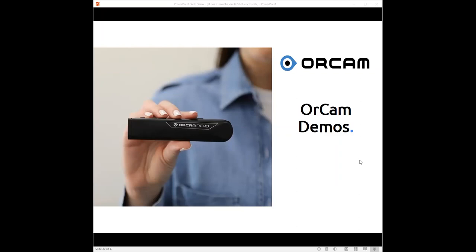I'm going to double tap. I double tapped on the very front button on the trigger button. I get the series of beeps to tell me that it's in pause as opposed to being completely stopped. Everything is audible on the OrCam devices. I don't need to see anything to be able to operate it because I get audio feedback. Now I finish with whatever it was. I want to resume that paragraph. I'm going to double click in the same spot on the trigger button.